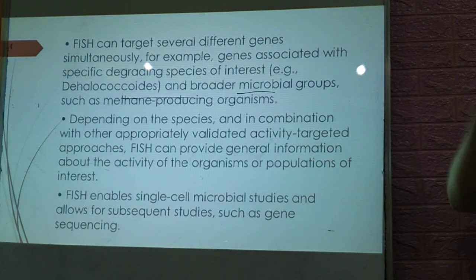For the previous ones, there was only one gene of interest. For this one, we can have several genes of interest in just one specific cell. Which means, guys, we can make use of different colors or different labels or different fluorescence or fluoresceins.